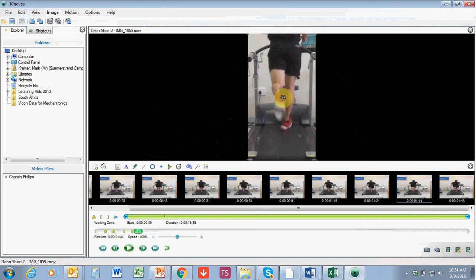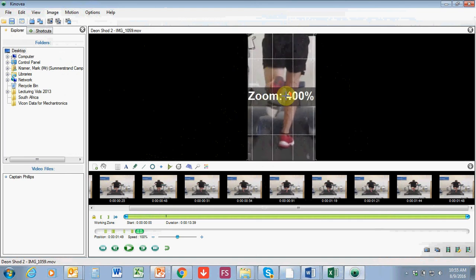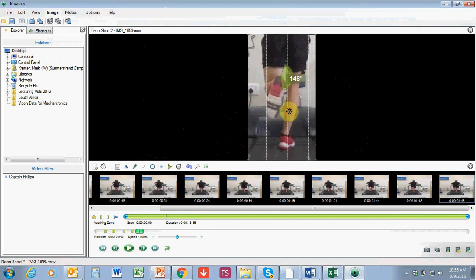Okay, so we'll delete that. We've checked that. The other part that we want to look at is his medial heel whip. So again, we'll use the perspective grid, or just the normal grid, in order just to facilitate this process. Make sure that our lines are completely straight. So the axis goes on mid calcaneus, other arm goes, oopsie, wrong one. Okay, let me just delete that. I'm just going to try that again.